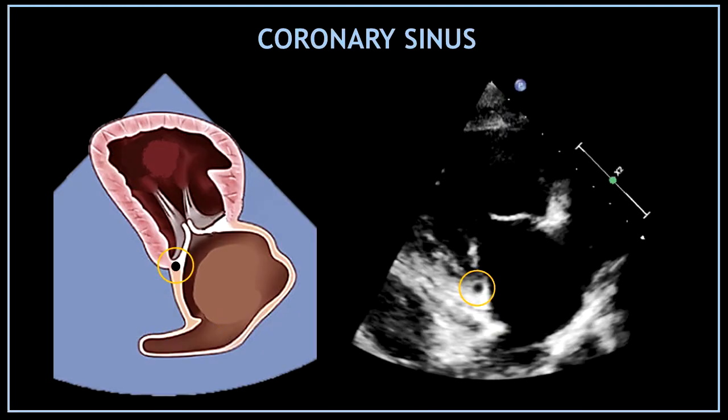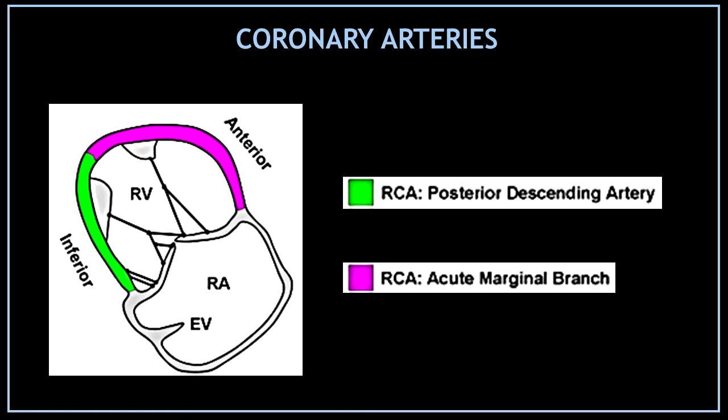This tiny black circle next to the tricuspid valve annulus is the coronary sinus. And here you can find the coronary arteries in charge of supplying blood flow to the right ventricular walls.